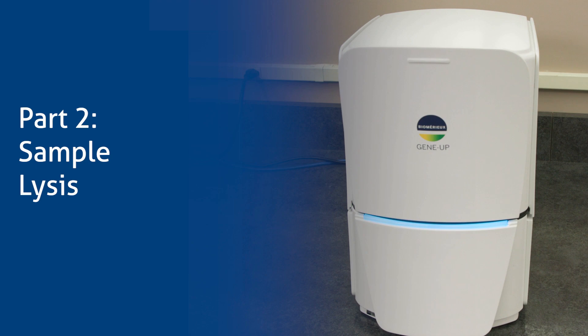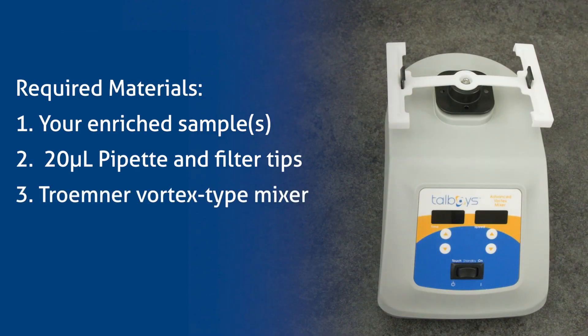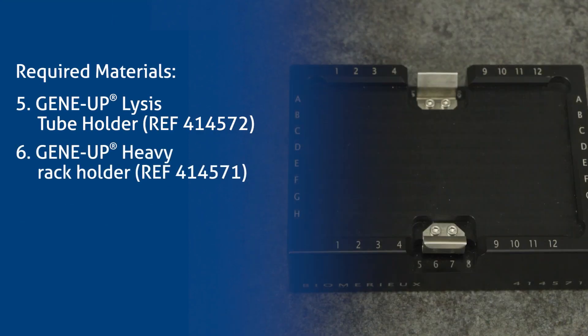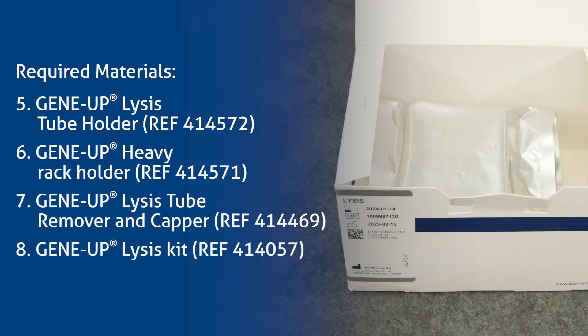Part 2: Sample Lysis. Required materials: your enriched sample, 20 microliter pipette and filter tips, Trumner Vortex Type Mixer, Trumner Vortex Mixer Adapter, GeneUp Lysis Tube Holder, GeneUp Heavy Rack Holder, GeneUp Lysis Tube Remover and Capper, and GeneUp Lysis Kit.